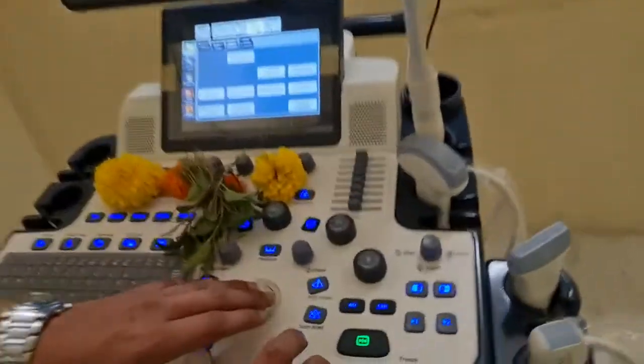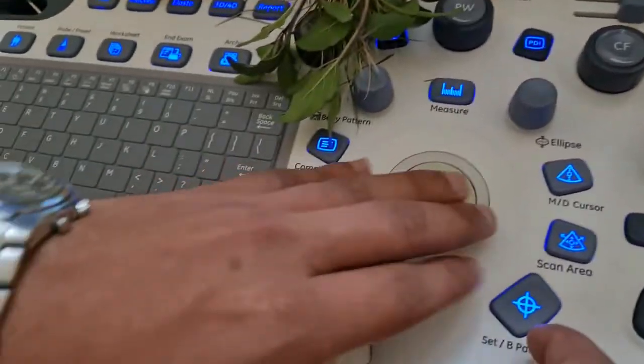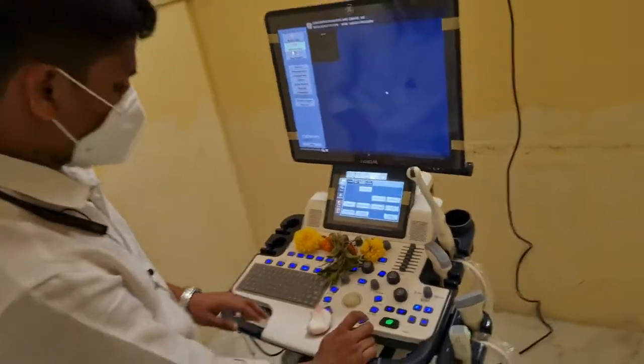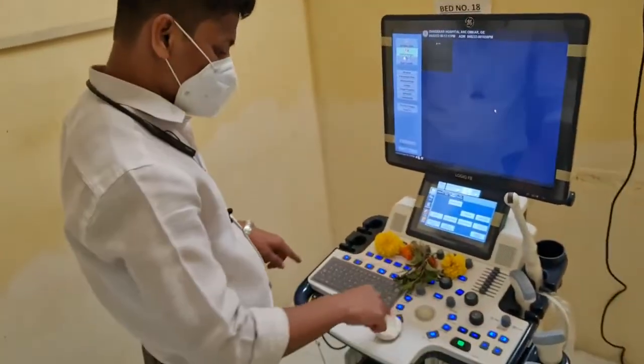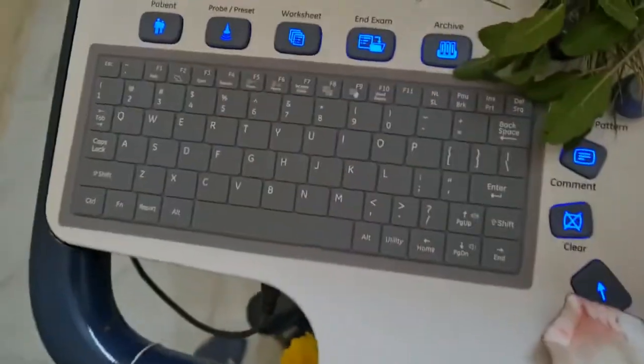So this is the trackball, used for movement of cursor. After this is the AN keyboard, alphanumeric keyboard.